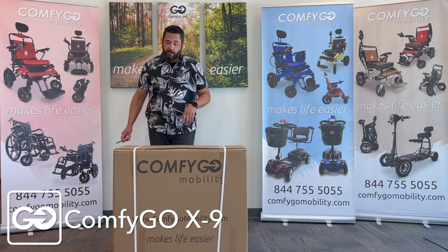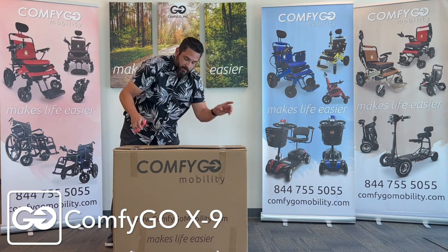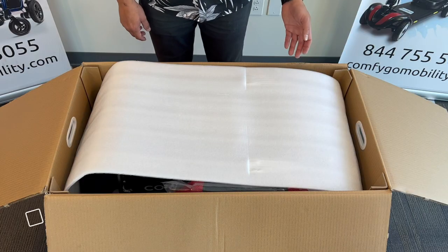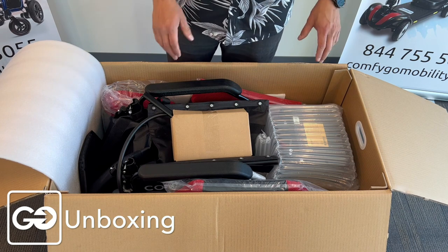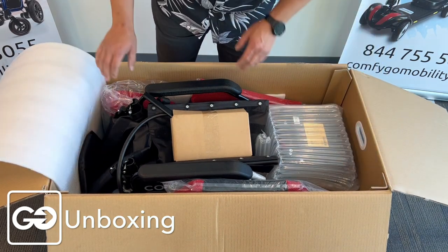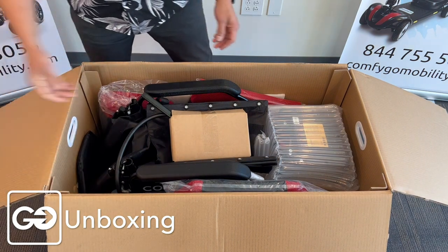Take standard house scissors and we're going to cut the straps off the box. So this is the packing here. You're going to notice, first thing, that we have a very nice, robust packing process here, so your chair will be protected very well. We've got some corner pieces here to protect it from falls, so when you get your chair, it's going to be in very good condition.